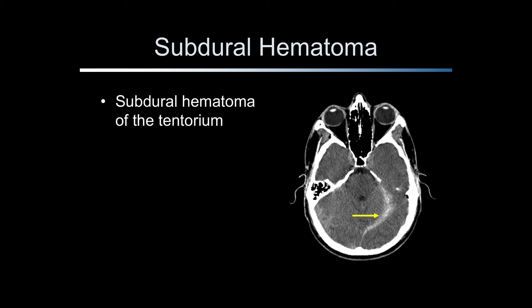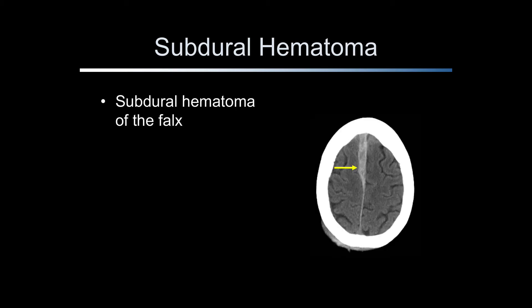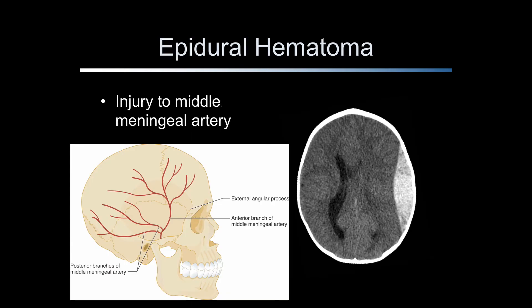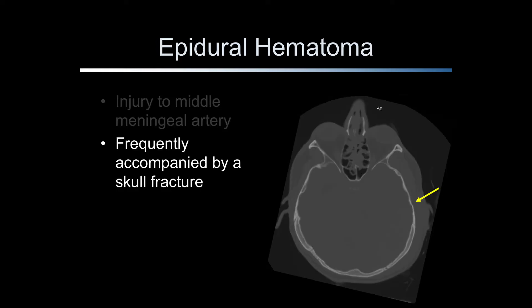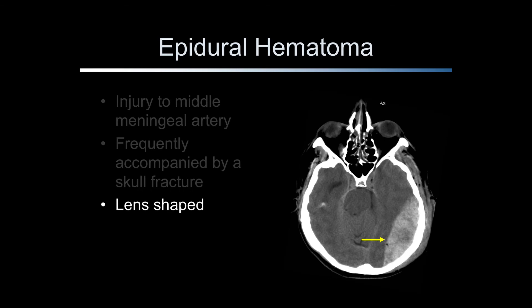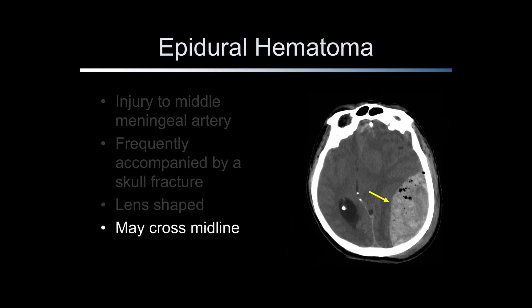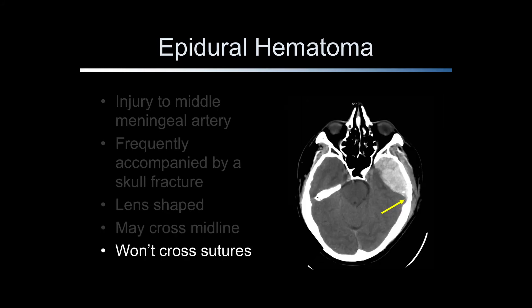Subdural blood can also collect along the tentorium, and can accumulate along the falx. The falx is a thin layer of dura that lies in the interhemispheric fissure. A subdural hematoma along the falx will appear as a hyperdense structure that is frequently asymmetric. Epidural hematomas are typically arterial in origin and most commonly occur from injury to the middle meningeal artery and its branches. They are frequently accompanied by a skull fracture. They are biconvex or lens-shaped and may cross the midline, but do not cross suture lines.